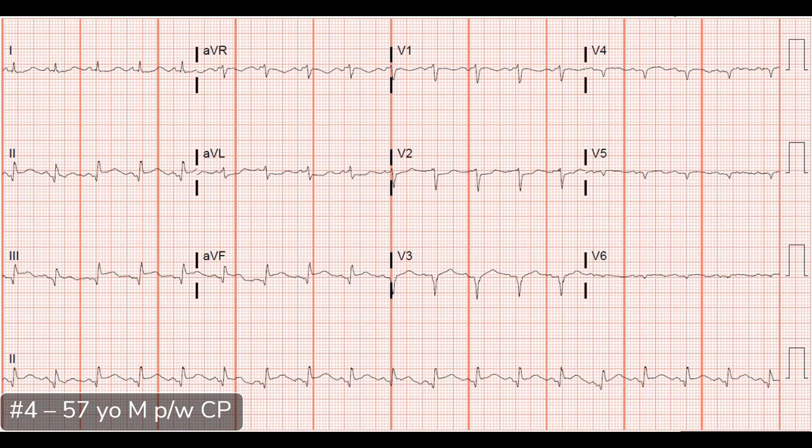Reciprocal changes really clinch the diagnosis, but that straightening of the ST segment — where you don't have the nice concave-up morphology, they look straight or horizontal — that morphology is pretty worrisome.